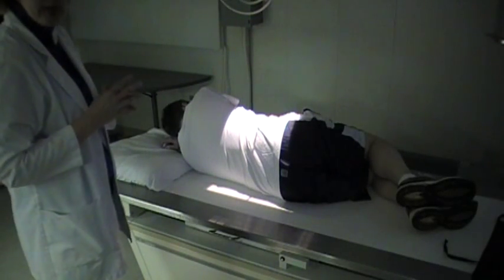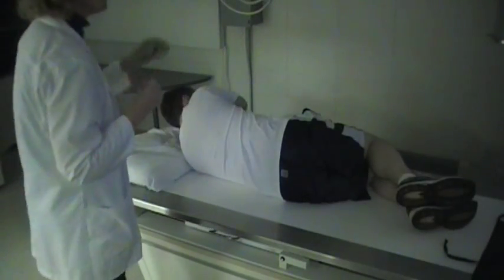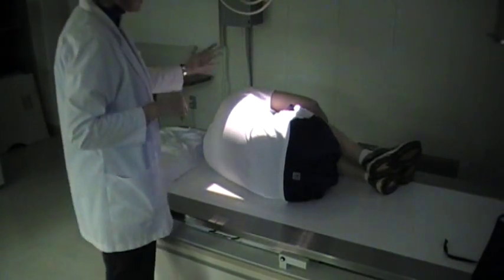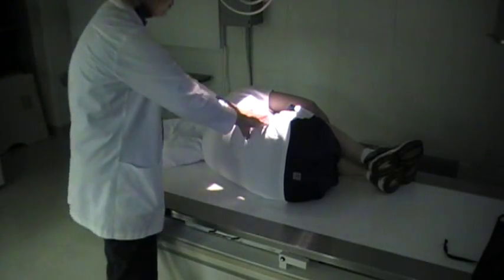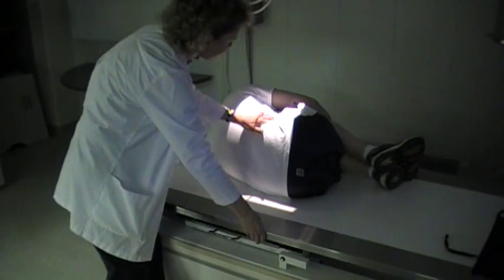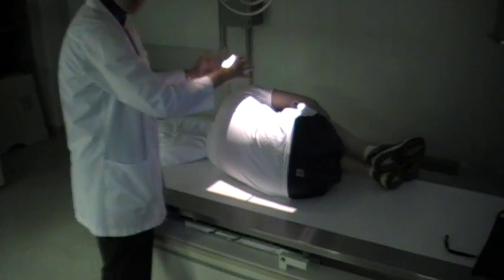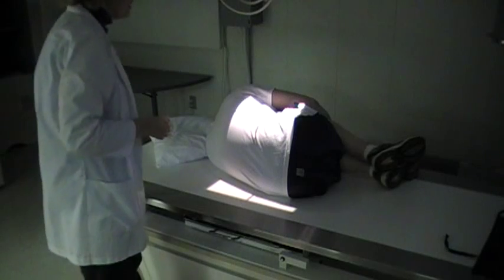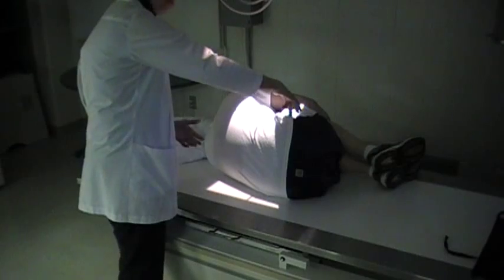When you do the hyperflexion, you're going to have the patient get in a ball. You're going to ask your patient to ball up. You can see David's bringing his head down and his knees up, and he looks all balled up. You want to check the crest again and center at the crest. With him bent up like this, it's really not a good idea to collimate, because you've got the spine going forward and then you've got this still in place.